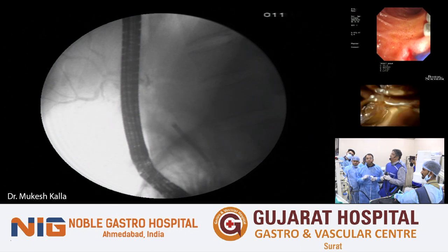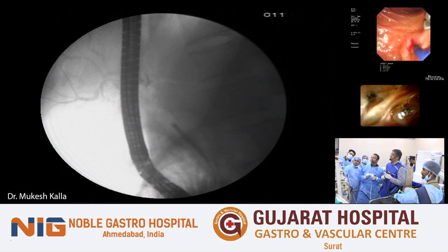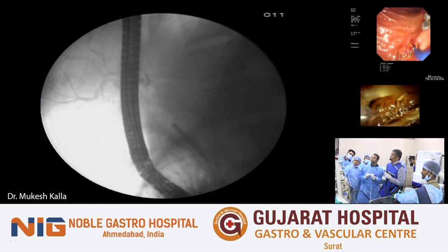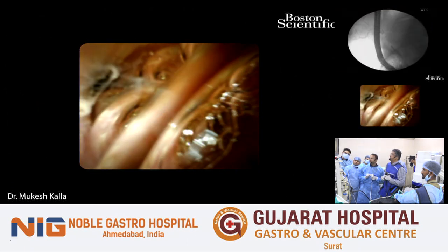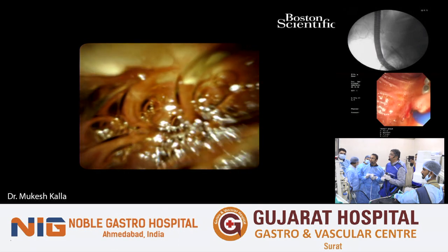So as in a GJ, as we see afferent and efferent loop, the area from which the bile is draining is usually the common bile duct, and the area from which the bile doesn't drain is the cystic duct in cholangioscopy.